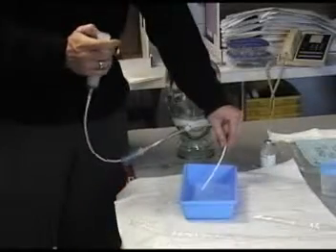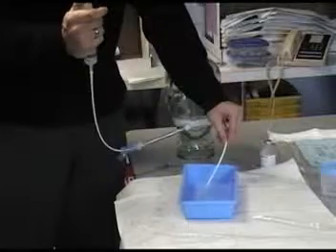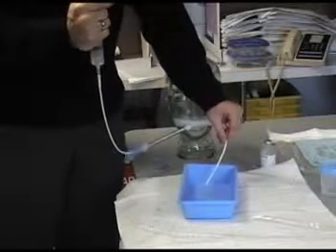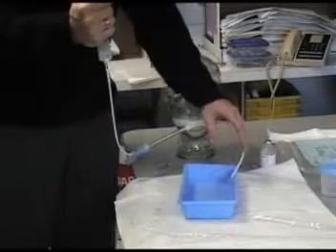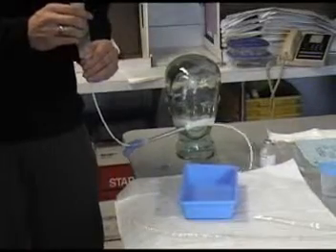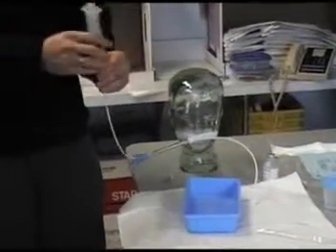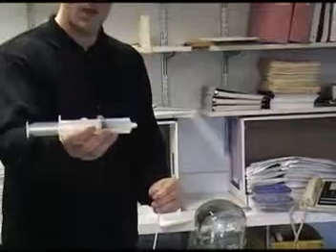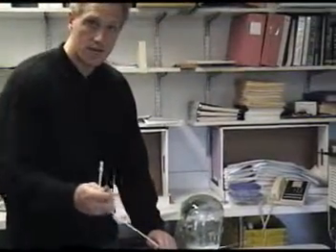Now immediately go ahead and bring back into the syringe. A lot of times you'll pull quite a bit of air back here, and you'll also get some saline back as well. 2 to 5 cc's of saline is really all the lab requires here to do the test that they want to do. So once you get that, you're in pretty good shape, and you can go ahead, take your syringe off, which you've now got your sample in, place that down, and now remove the catheter.